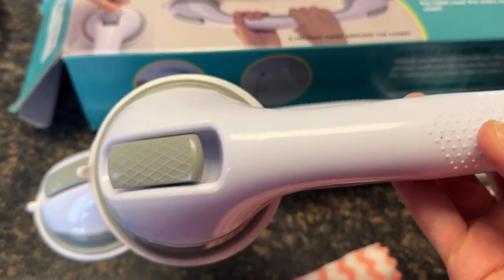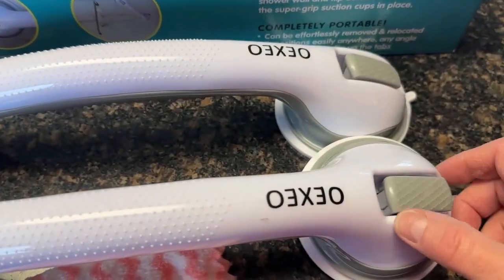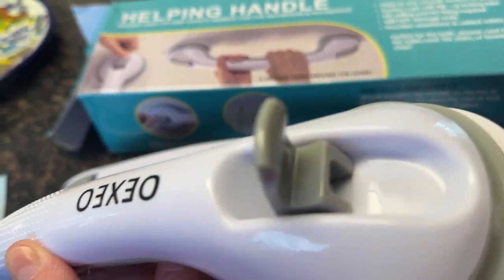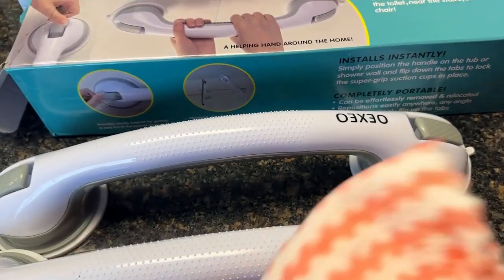Nice big suction cups on both ends, and then you can see these little locking mechanisms at the end. You just pop them up, and that helps you grab the suction when you're putting it onto the wall, which is really important. And then this cloth is to help keep it clean and remove any debris.